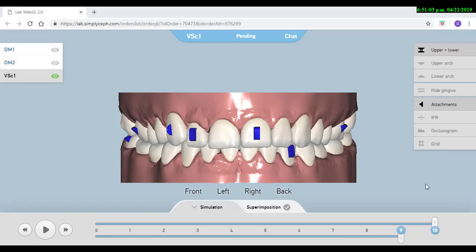It is very important that whenever I'm evaluating the final position to always have the photos of the patient at our side. We want to see how those movements are affecting that patient smile.